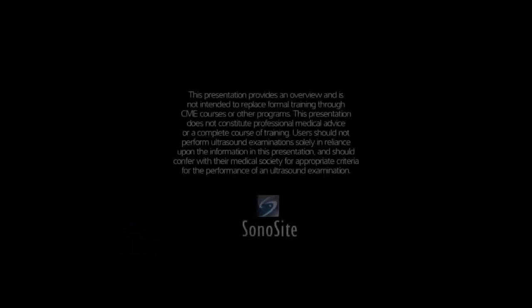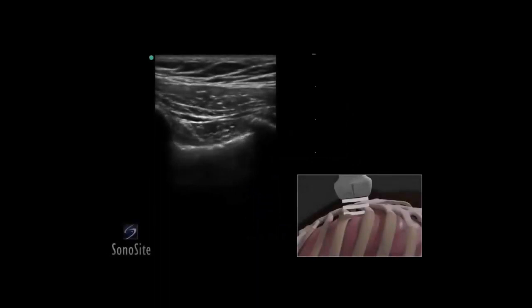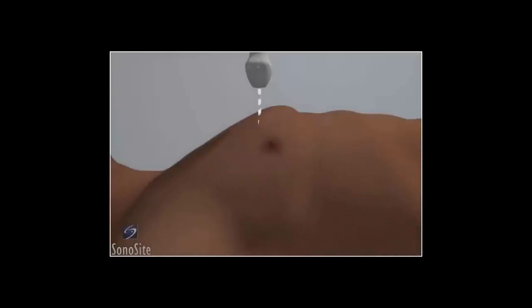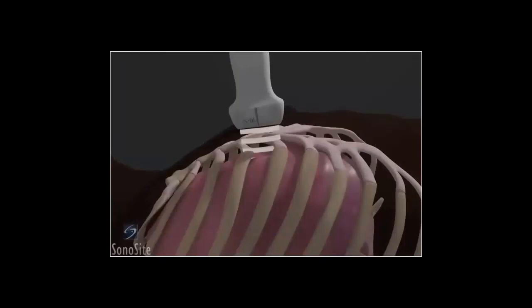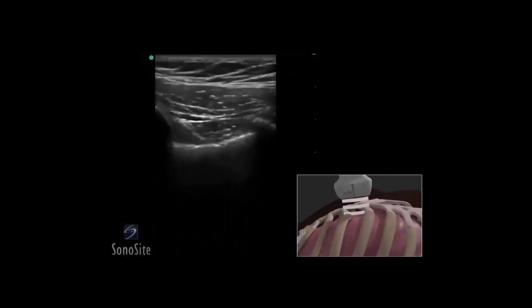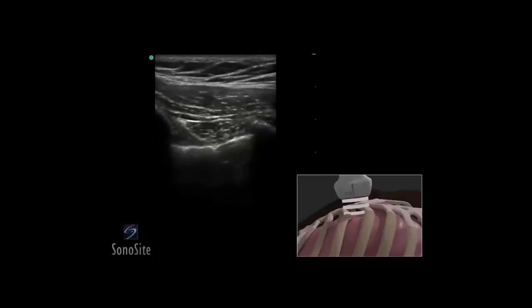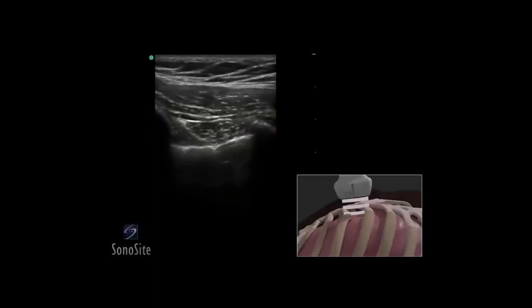A linear array transducer is used to evaluate lung sliding as an extension of the FAST exam. The orientation marker is positioned in the direction of the patient's head. The transducer is placed in a long axis orientation over the anterior chest wall at the third or fourth intercostal space, in the anterior axillary to midclavicular line. The ribs are identified in the near field of the image as a bright interface with a posterior shadow. The pleural line is identified as a bright hyperechoic line between the rib shadows. The to-and-fro sliding movement of the visceral pleura against the parietal pleura with breathing generates the lung sliding sign.